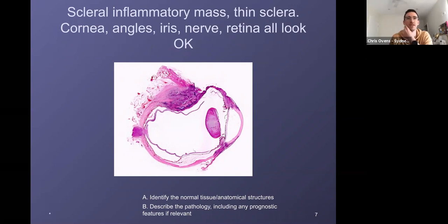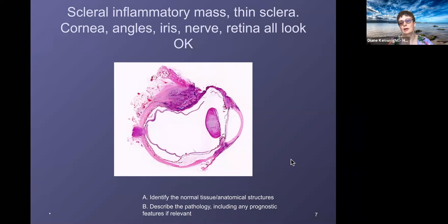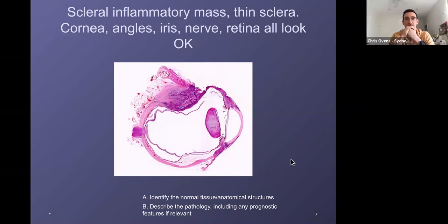Because when I look at that, I think, oh, big yucky mass thing, and then compare that to the next slide where it's a well-defined, ordered something.